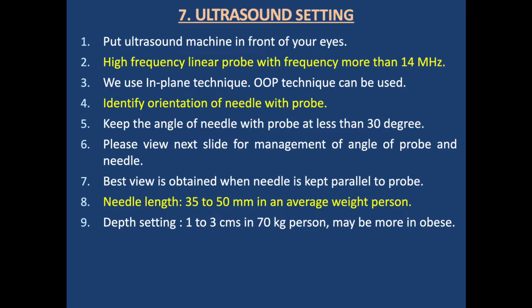Best views are obtained when the needle is kept parallel to the probe. Needle length should be 35 to 50 mm in an average weight patient, but in obese patients we may need an 80 mm length needle. Depth setting is 1 to 3 cm in a 70 kg person, according to the patient.